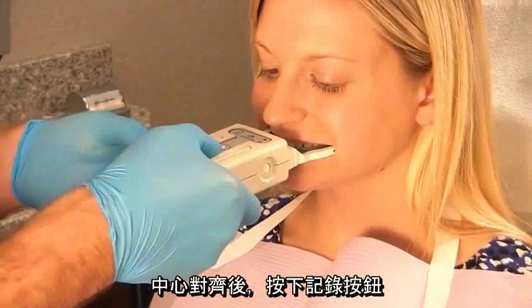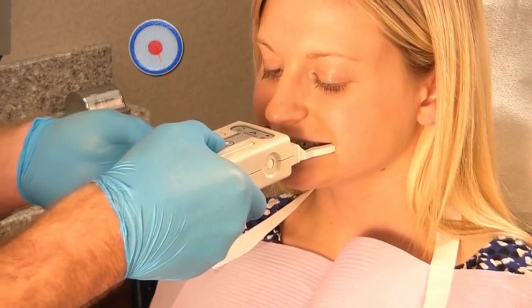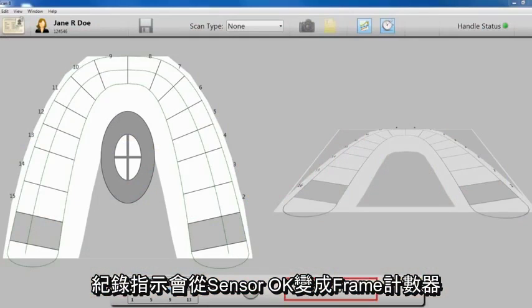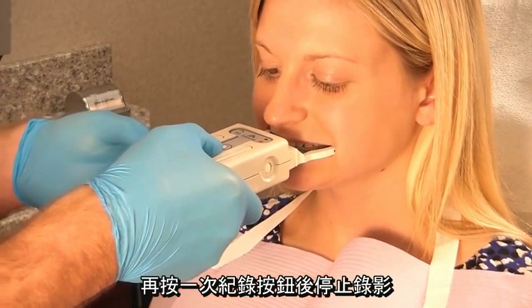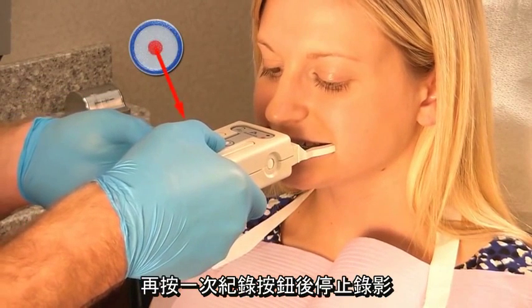With the sensor in your patient's mouth, press and release the red record button. The sensor status indicator will change from Sensor OK to a frame counter, and the green record light on the handle will illuminate. Have your patient bite, clench, and release. Click the red scan button again to stop recording.